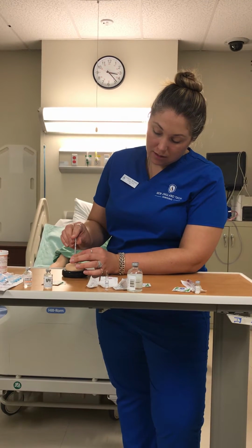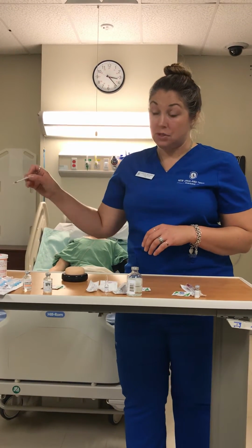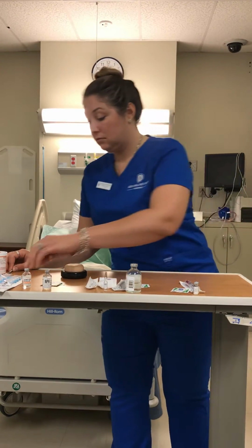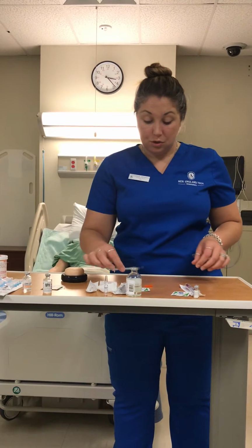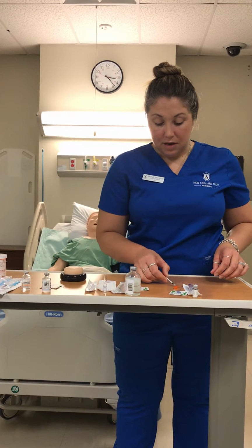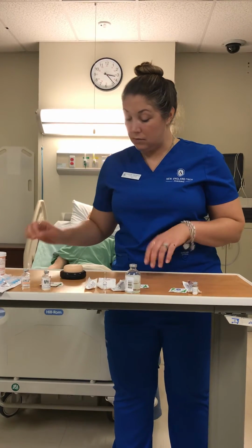And administer the medication, pull back, and immediately dispose it into a sharps container. Be sure not to rub the area as well. Okay, and you don't want to recap the needles. You can use the scoop method because once it's been in the patient, could be at risk for different kinds of infection. Into the sharps container.